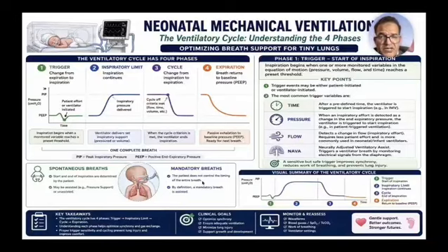For the patient to synchronize with this, there is a window. If the patient meets this window, his breathing will be supported by the vent. If he misses this window, his breathing will just go to the baseline and will be supported only with the PEEP.